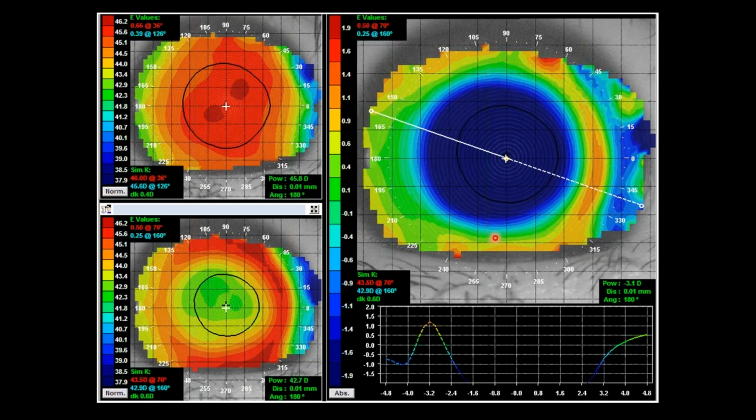And notice how your lens is well vertically centered. The treatment zone is well vertically centered, but the blue treatment zone appears farther to the temporal side than it does to the nasal side. And that's because the lens is just following natural corneal displacement.